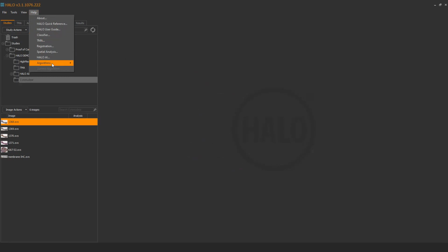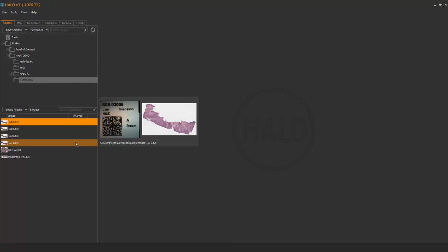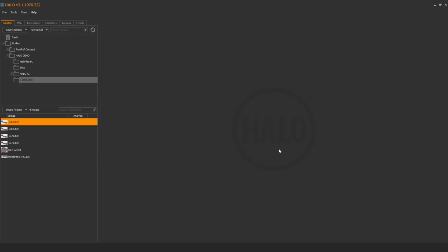Okay, so very important to mention before we get digging into the workflow that this is your go-to guide. As a follow-up, there's also a learning portal, which is on the Indica Labs website with access to webinars, videos, application notes, that kind of thing. And then, last but not least, the applications team is ready to assist any of you with training or troubleshooting. And we have a file transfer protocol in place, so you can upload images to our SharePoint, which we can then review, optimize the analysis, and discuss either the results that we've got and how you should use the software in its best modality to get the best result.